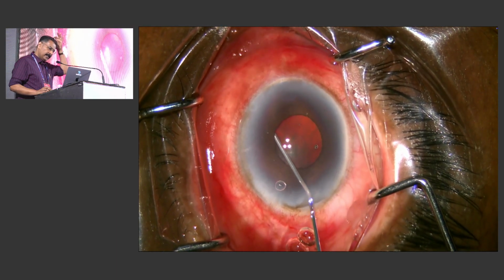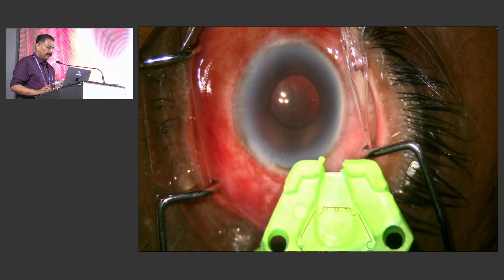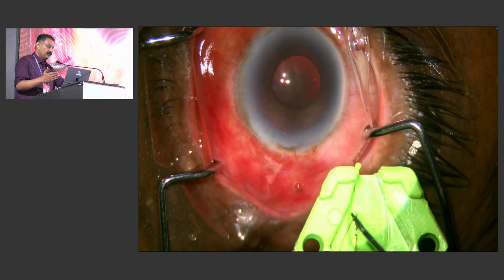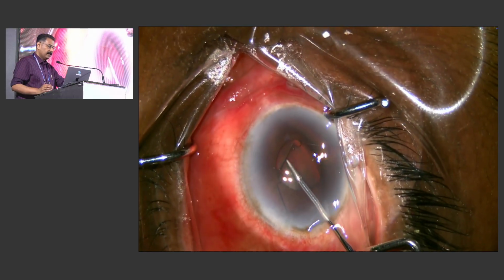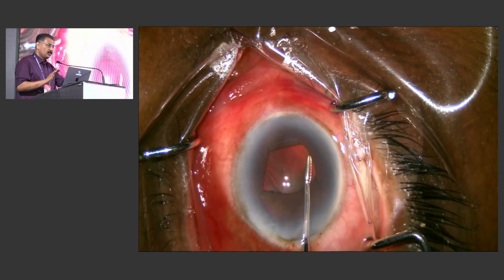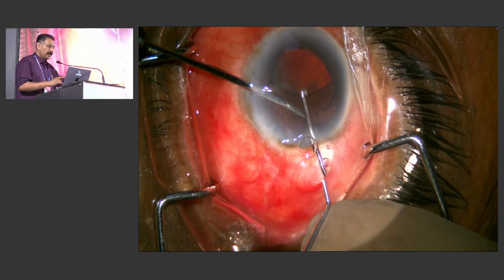See the harder cataract. So the visco underneath this one and underfilling the anterior chamber is very important. This is the 2.0, which is bigger, so you'll get a 5.5 to close to 5.75 opening. And this is the forceps which comes with the B-Hex. For the first one, you can use the paracentesis or the main incision. I put some sodium hyaluronate also inside so that it doesn't shallow. So this is one important point.